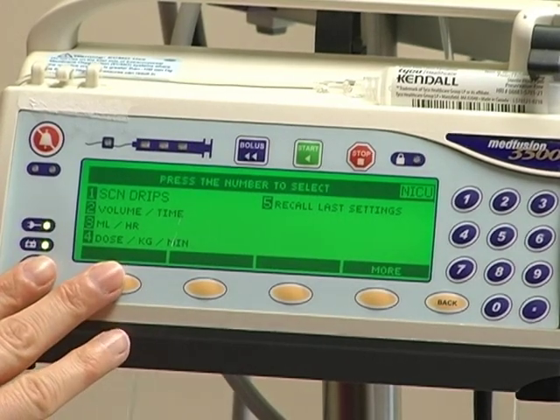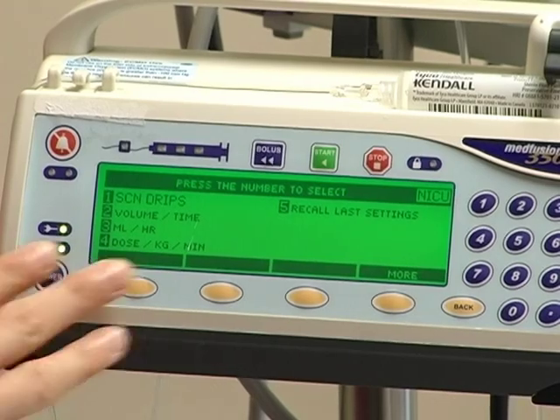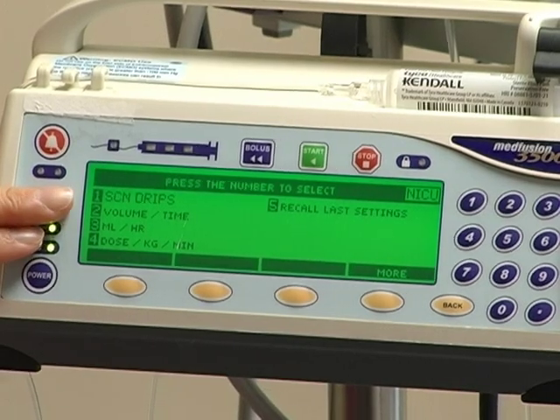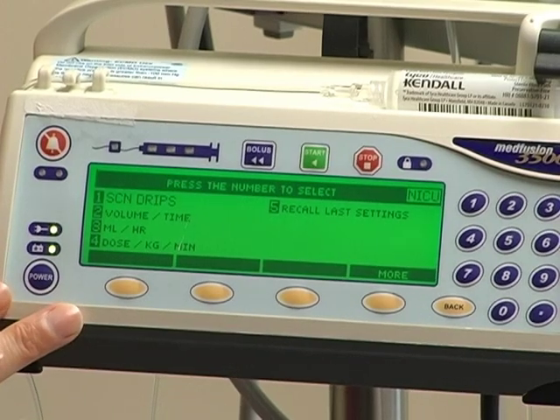You may see two types of pumps here on Pediatrics. We do have one pediatric Medfusion pump. This pump is set up for the NICU, which is not a big deal. The two settings that we need — volume over time or milliliters per hour — are still options on the NICU pump.